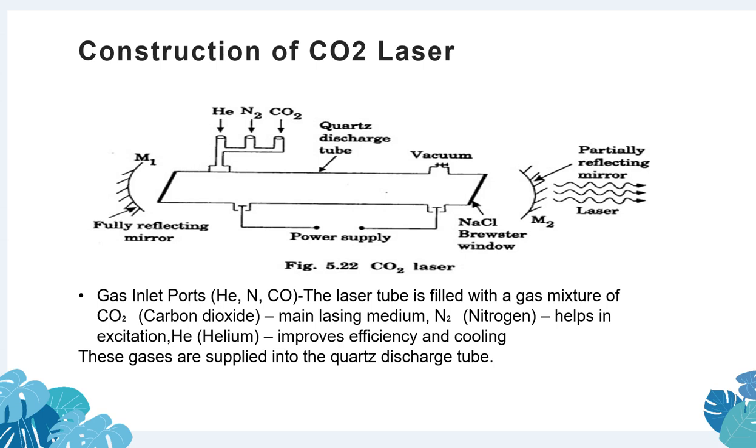The laser tube is filled with a gaseous mixture of carbon dioxide, helium, nitrogen. As I said, here the carbon dioxide is the lasing medium, nitrogen helps in excitation, and helium improves the efficiency in cooling. These gases are supplied into the quartz discharge tube. Here, this is the quartz discharge tube.